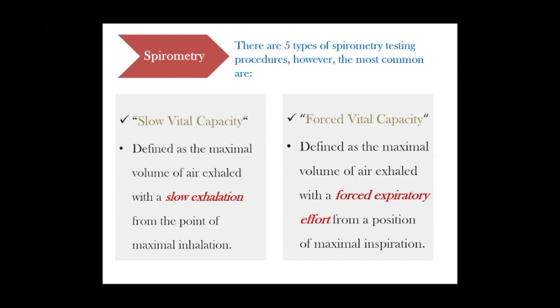However, for forced vital capacity, I will ask the patient to breathe normally first. Then I will ask him to take a big breath in, then blow, but forcefully and rapidly. So this is the difference. For the forced test, it should be forceful, so that we are able to measure the forced vital capacity for the patient.